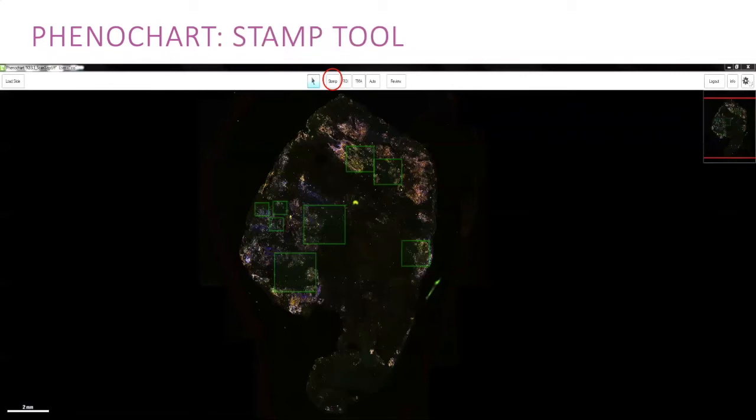Alternatively, if you have a very large tissue section and are only interested in acquiring certain regions of your sample, you can use the stamp tool to select your MSIs. You have the option of a 1x1 stamp, a 2x2 stamp and a 3x3 stamp which is equivalent to 9 MSIs.